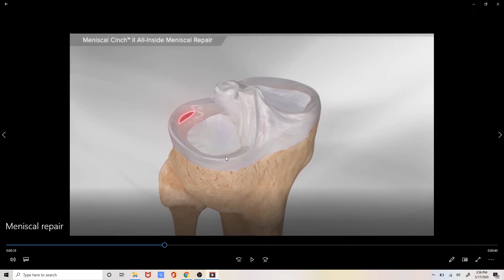The outside meniscus is called the lateral meniscus and you can see it come all the way around the periphery of the joint. The inside meniscus or the medial meniscus comes all the way around the periphery on the inside portion of the joint.